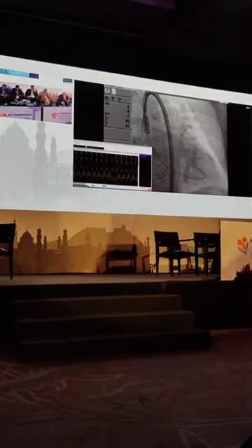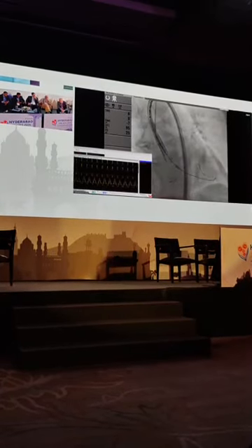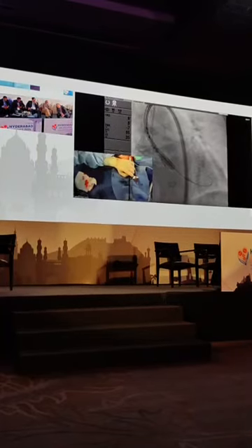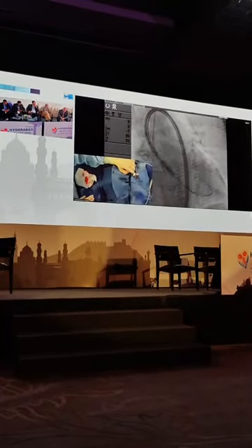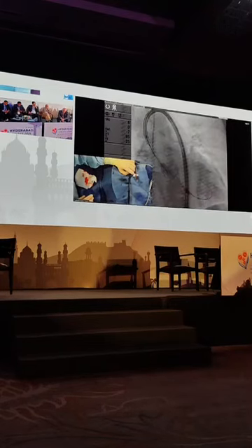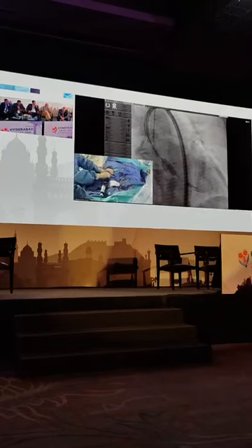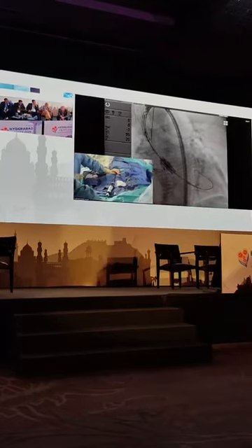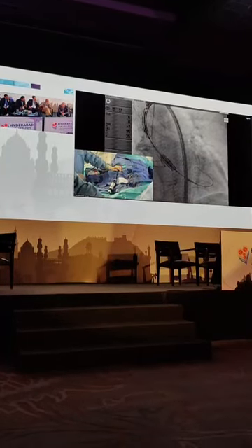So now we are in the projection view. So we'll cross the valve. So I pull a little on the guide wire. You see, it crosses very easily, and in this case there was no predilatation, remember. And Christophe will pull back the delivery catheter and now we have a pretty good position. I think we can go a little wider. We have the position of the pigtail, which indicates the depth of the aortic sinus.